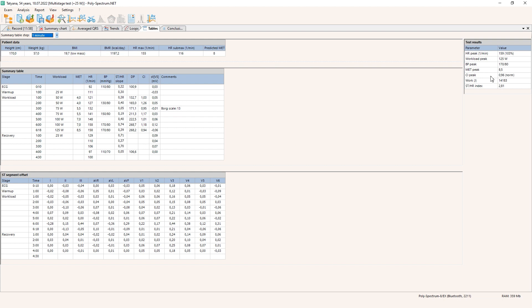Also shown are heart rates during every stage, blood pressure measured, double product calculated from systolic blood pressure and heart rate, and chronotropic index showing if the patient has chronotropic incompetence. Here it's 0.96 — almost normal. The maximum peak heart rate is above 100 percent of age-predicted, meaning this patient achieved a maximum heart rate exceeding the predicted level, so no reason to think about chronotropic incompetence. Borg scale data is included in the comments column.